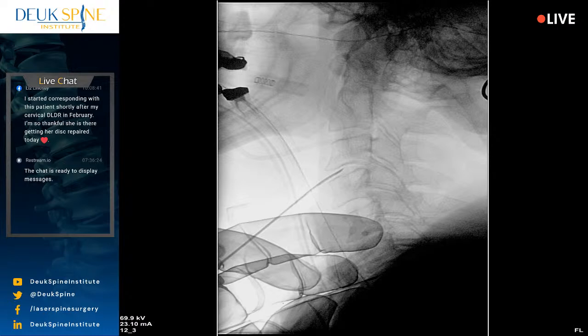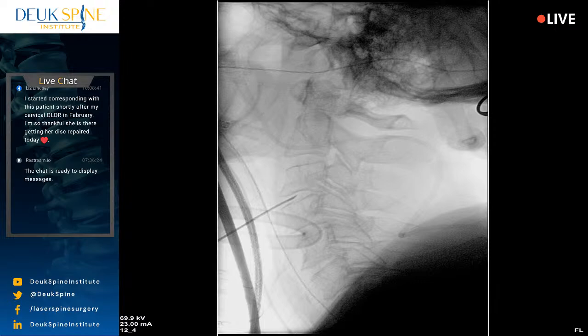All right, now who's pulling on the arms? You are? Not too hard. And let's just see what we've got with Luis giving a shoulder pull and you giving a shoulder pull. Come on. Shot. All right, so 2, 3, 4, 5, 6, 7. That's really good. If we could just keep that view. You should probably come a little more south, Jordan, just a little bit, like a half an inch at most.